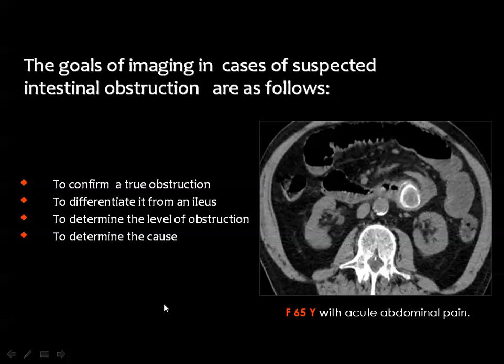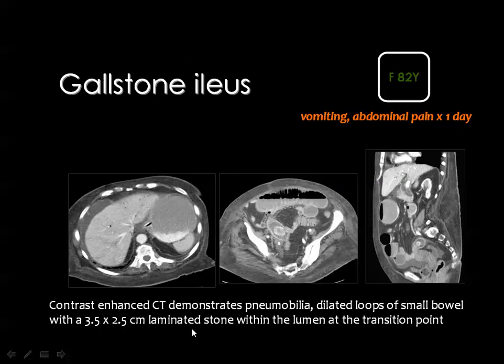Then the goals of imaging in cases suspected to have intestinal obstruction in general is to confirm the diagnosis, to differentiate mechanical from functional obstruction, and to determine the level of obstruction as well as the cause of obstruction.